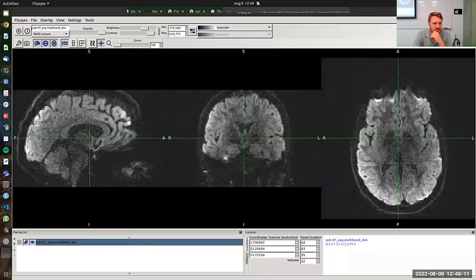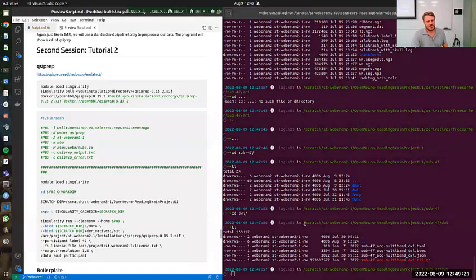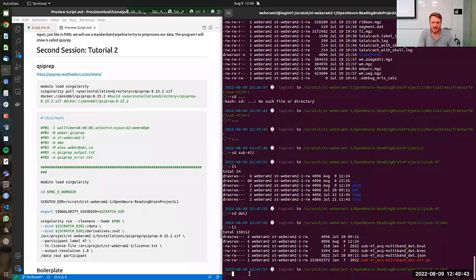I can show you what that looks like once we run our pre-processing. So it's not just X, Y, Z, it's coming at every direction. Right, we're doing a whole sphere, and oftentimes people get 30 to 60 directions. More recently people are getting multiple b values. So instead of just b0 and b of some strength, let's say 1000, they're also acquiring b1000, b2000, stuff like this.